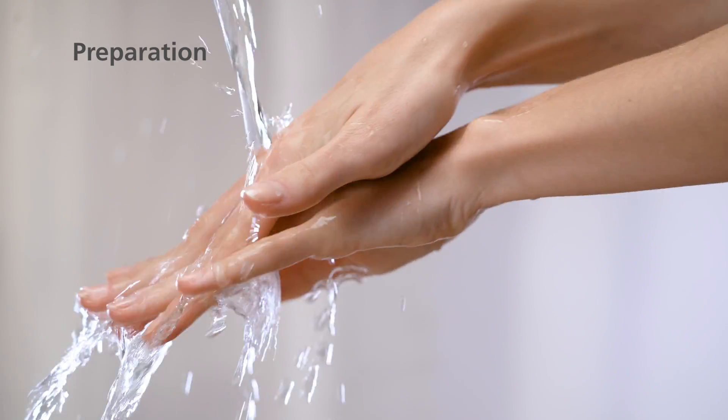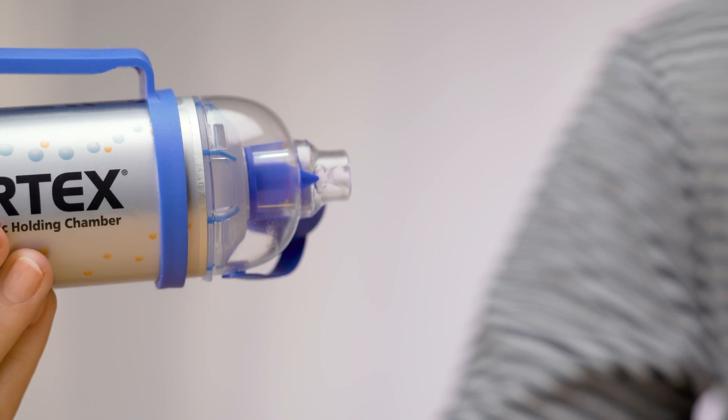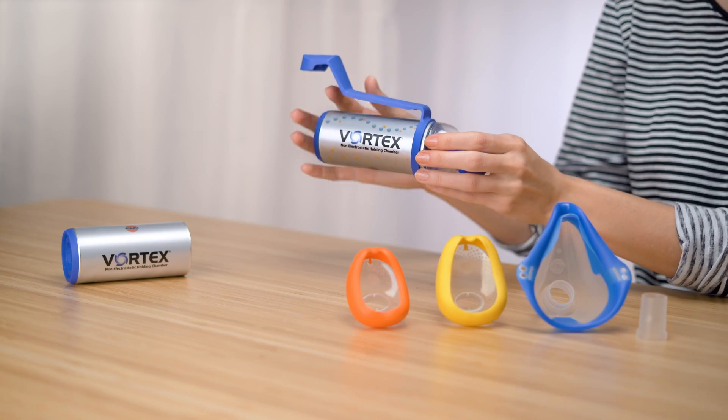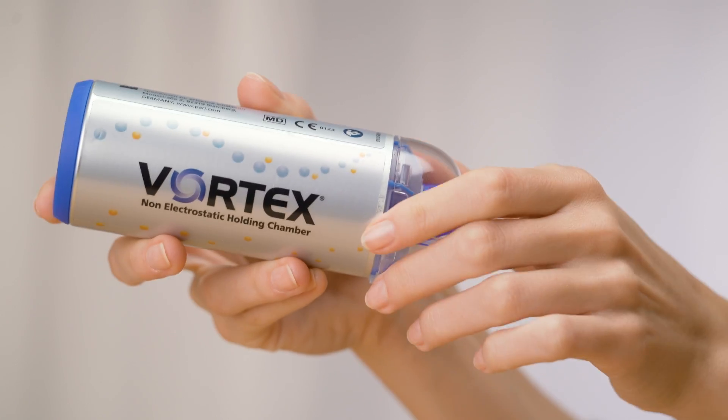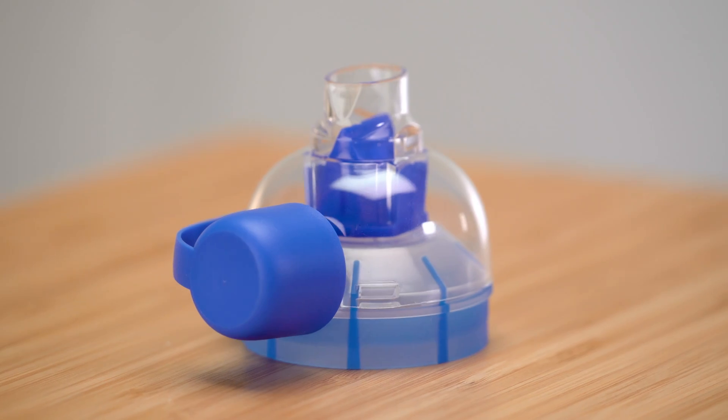Wash your hands thoroughly before each cleaning session. Detach the mask from the mouthpiece. Remove the dose inhaler from the connecting ring. Disassemble the Vortex into its individual parts, and make sure that the protective cap is open.